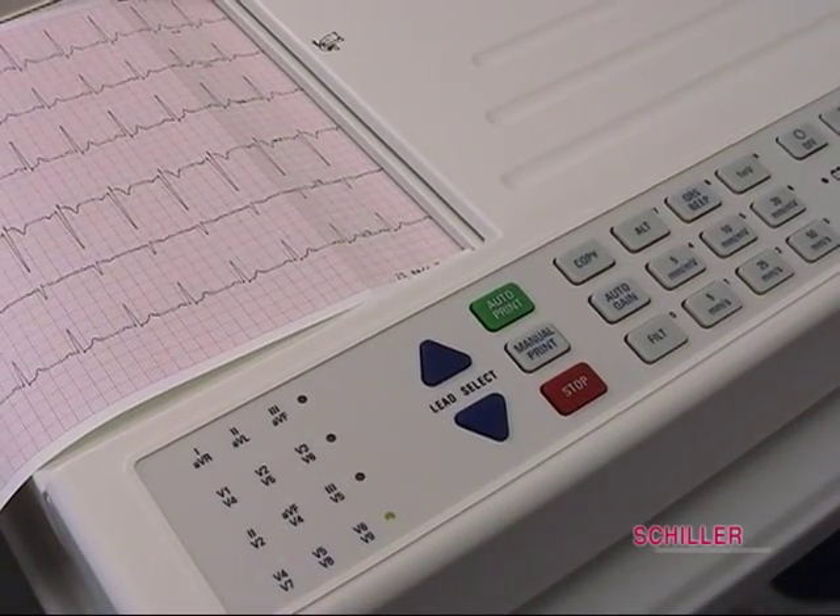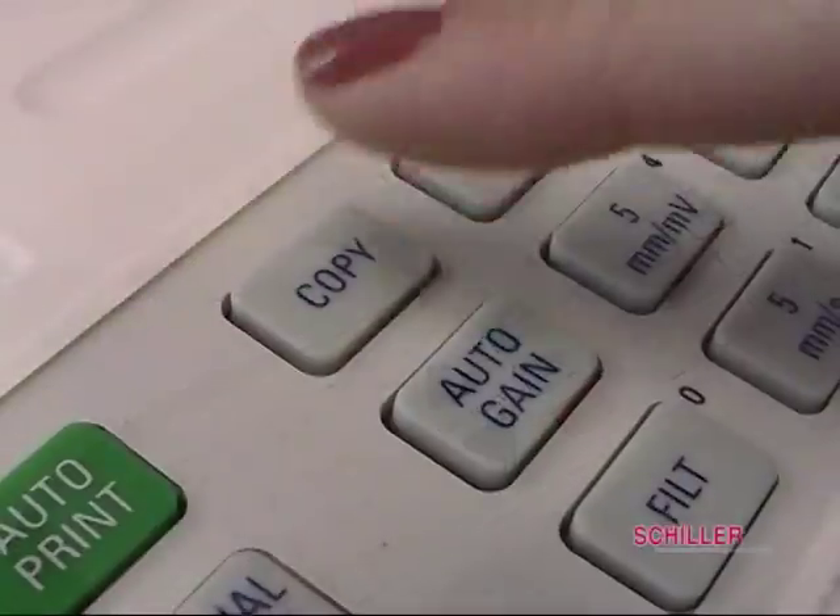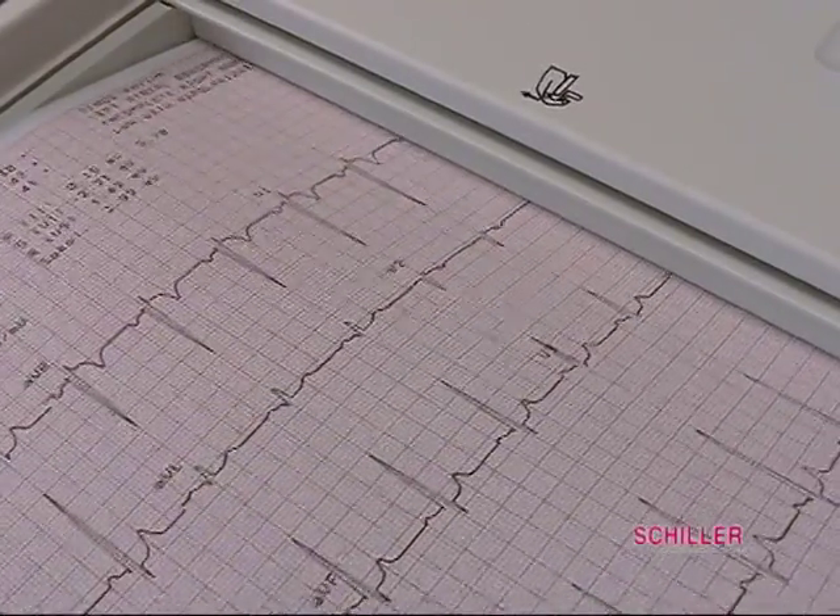To stop the manual print, press the orange stop button. Press the stop button again to reset the paper. The copy button will make a copy of the ECG just done.